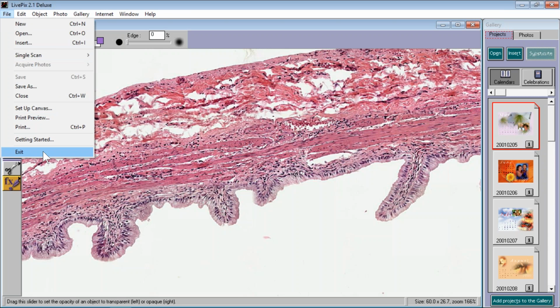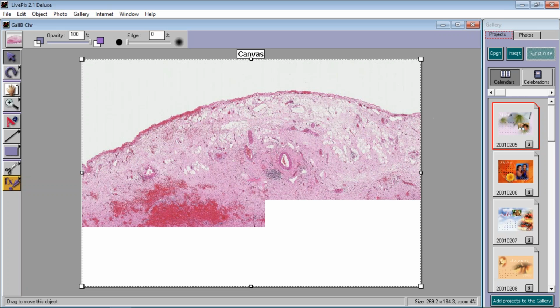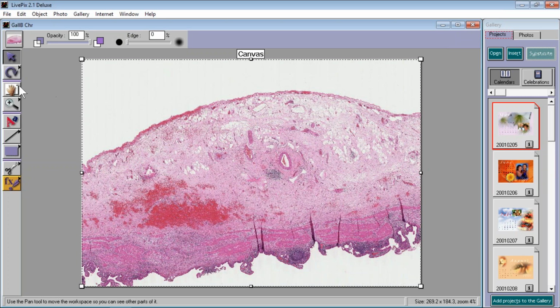Now I'm going to show you something interesting. I'm going to show you another gallbladder, and I'm going to have you make the diagnosis. And you're going to say, hey, this doesn't look like the other one did. You're going to say, you know, there's something wrong with this. It looks like it might be a little edematous. There's some hemorrhage. There are some inflammatory cells here.